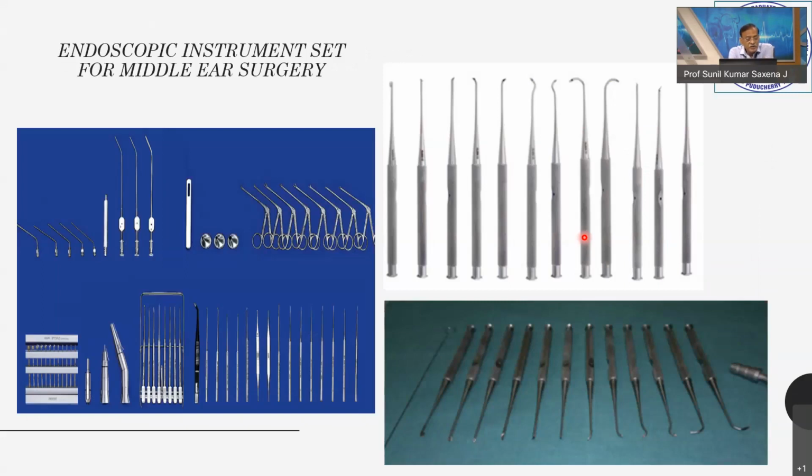These are the endoscopic special instruments by Panetti, an Italian instrument. The advantage of these instruments is that all of them have suction with them. So when you are elevating, at the same time you will be suctioning also. When you are with knife, with curette, with everything, there is a suction channel. And they are quite curved. You can reach the epitympanum or attic very easily with these instruments.